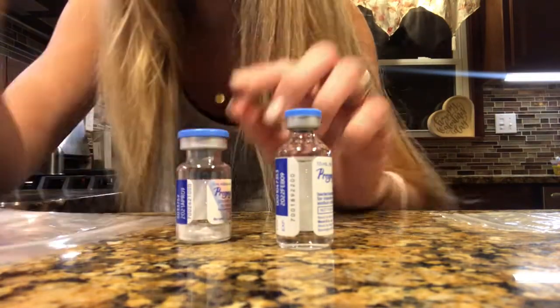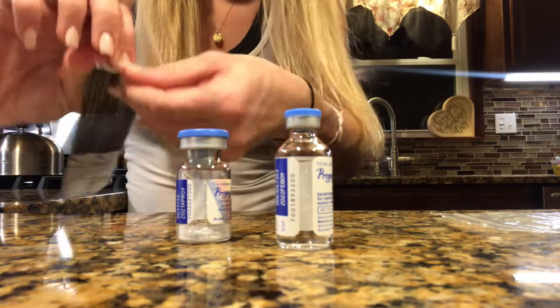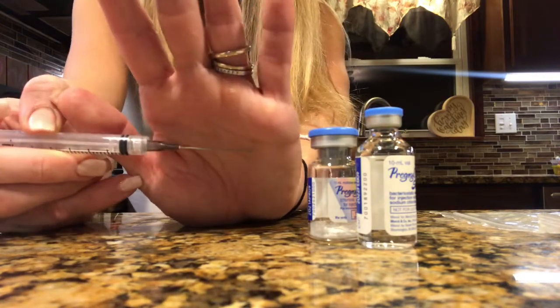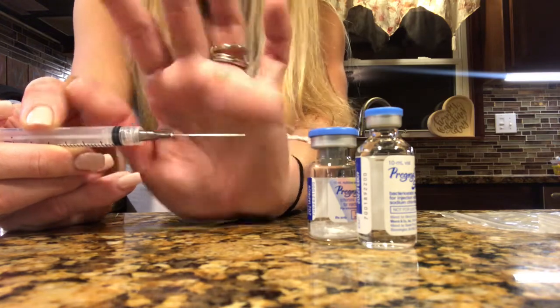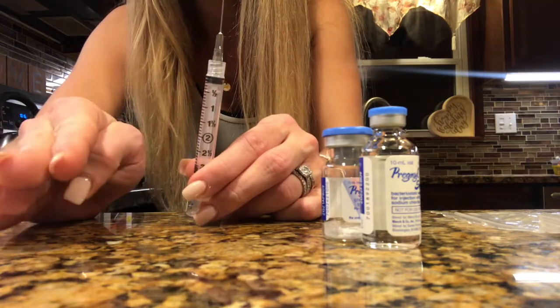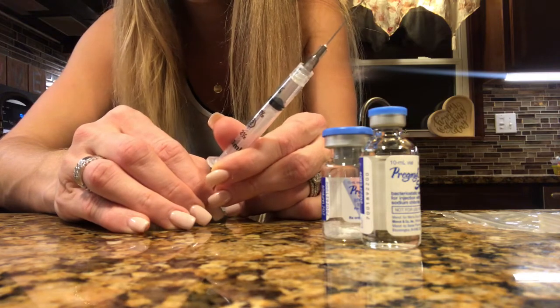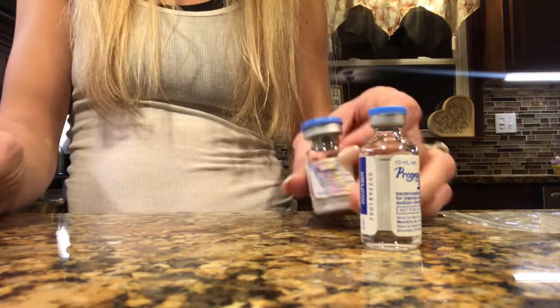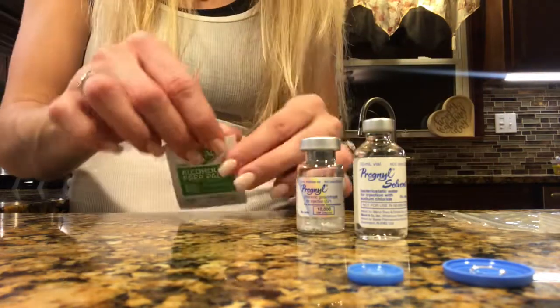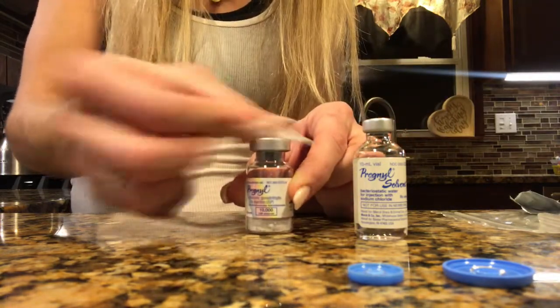First things first, we have to mix the meds. Go ahead and open up this box. You're going to have two vials — one has liquid, one has powder. We're going to take our syringe to draw up the meds. This has a very long needle on it, like the progesterone and oil needles that you use to inject yourself with.